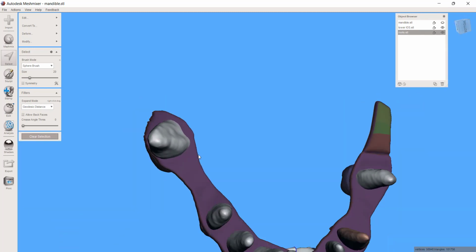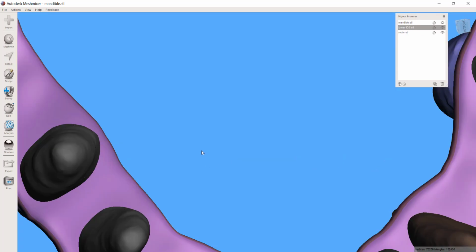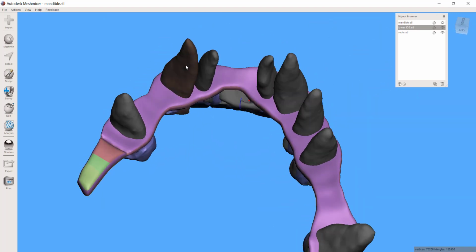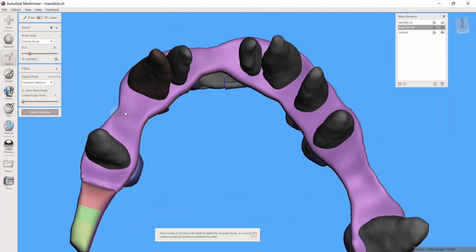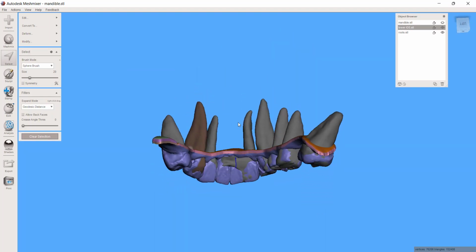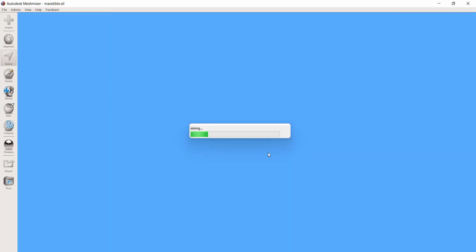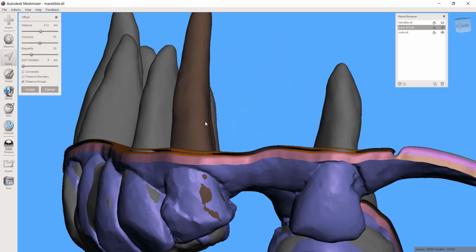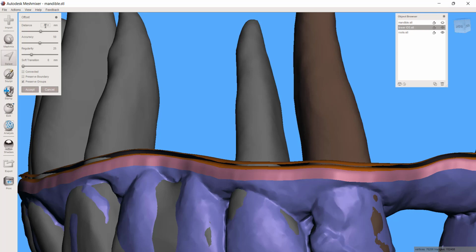If you don't mind being a little more advanced in the way you tackle this, then we could take another approach. All right, we've got all of this bottom of this model as a face group. Okay, so what I could do is take this. All right, I've selected it. Now what would happen if I went to edit and offset? All right, so you see, it's going to default to whatever the last offset distance you used was, and at the moment that's set at 0.3.